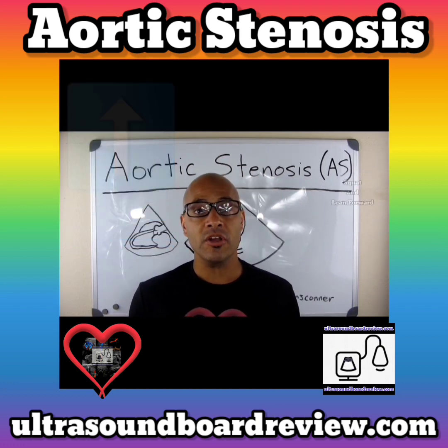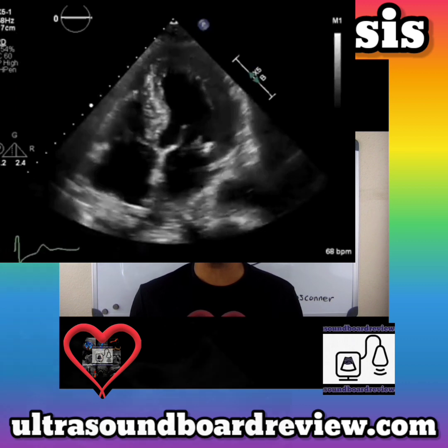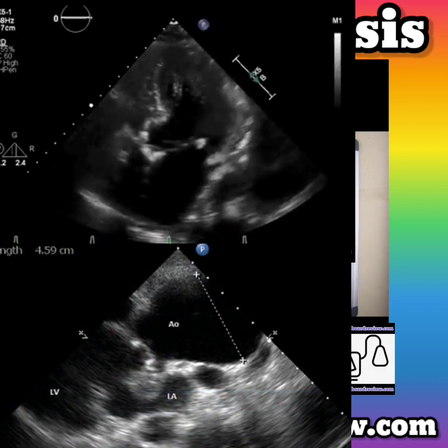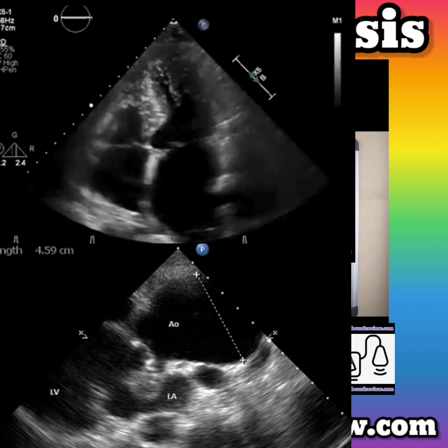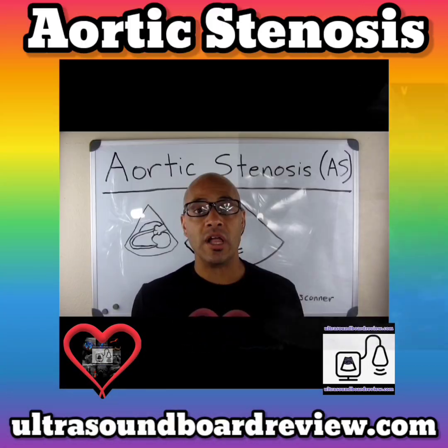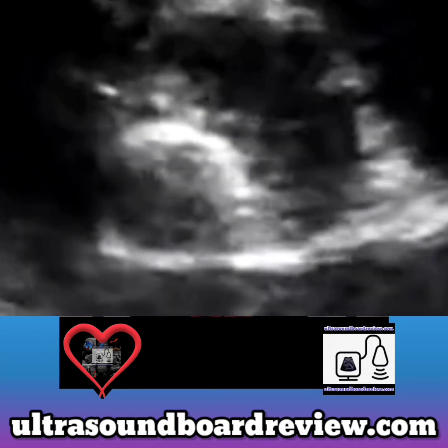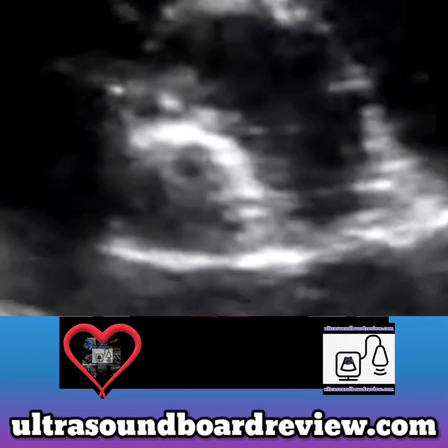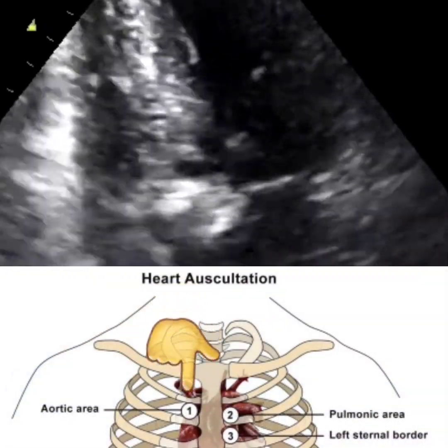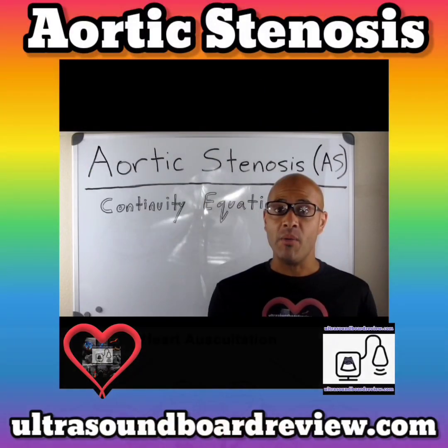Echocardiographic signs of aortic stenosis include left ventricular hypertrophy and a dilated sinus of Valsalva. The left ventricle will usually have a hyperdynamic contraction. The aortic valve will look like a brightly thick calcified hyperechoic valve with minimal excursion during systole, and this can be heard in the second intercostal space on the right side.